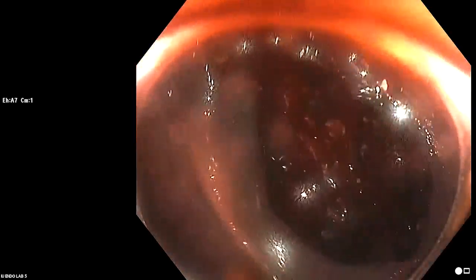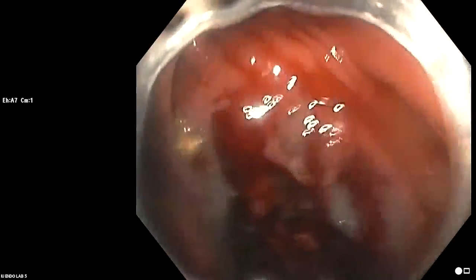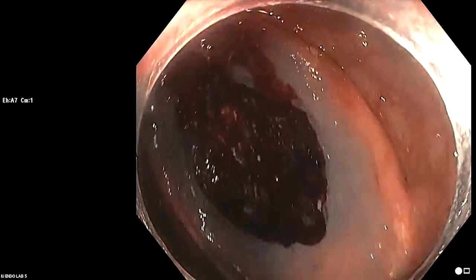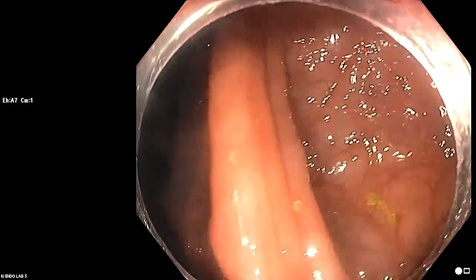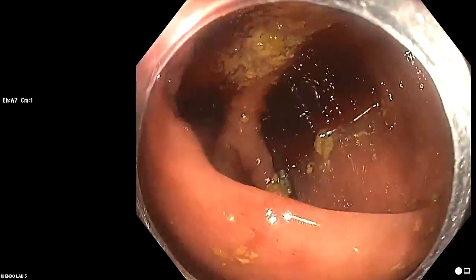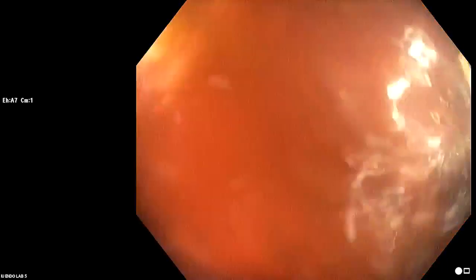When you have a patient with SPS and you have a large number of EMRs that you need to do, this is a very efficient way to get a large number of lesions out. And the other thing I think that's great about it is these patients have to come back for follow-up. And once they have a complication, they seem a little bit more leery, and you can just basically eliminate the risk of complication.